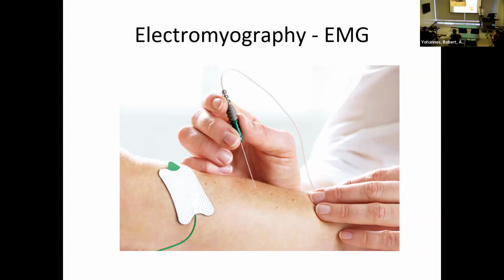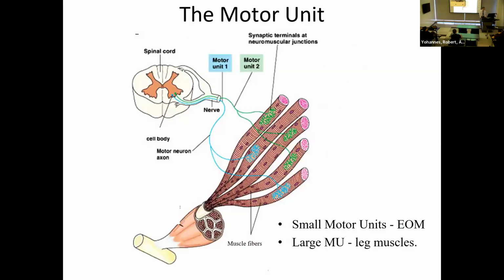Just an example, severe radiculopathy, we will know that it's severe when we actually have findings on the EMG, which is obviously a nerve problem. So don't think that those are separated into different diseases. These are 2 components of the same test. We call it EMG. That's how on the street we call the test, but just remember there are 2 parts to the test.